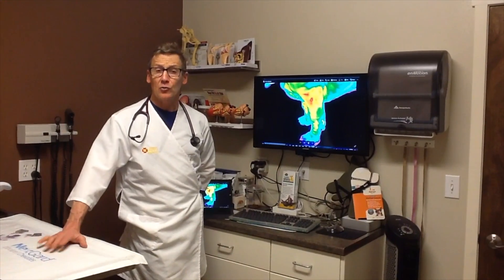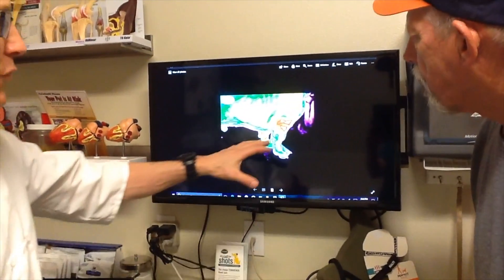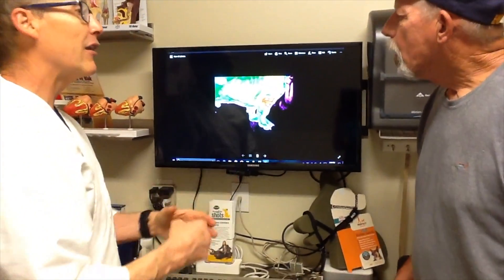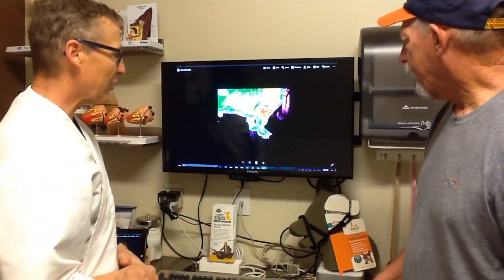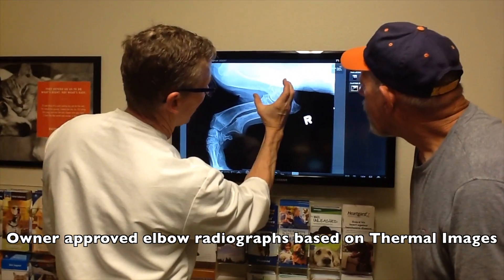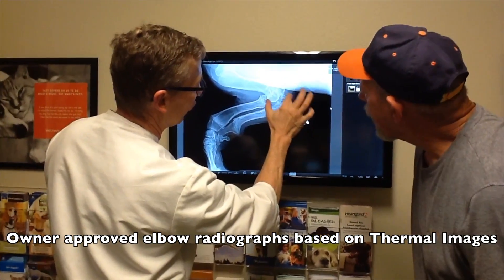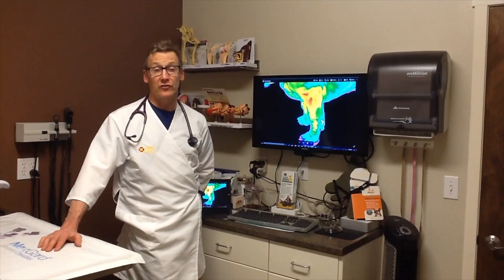So the digital camera told us to take some x-rays of those elbows. It doesn't tell us what's wrong there — it's just that in a dog that's not that lame, we know the elbow is where we need to look. Then we look at an x-ray and can actually see what the pathology is underneath. The problem was revealed as an ununited anconeal process along with some degenerative joint disease.